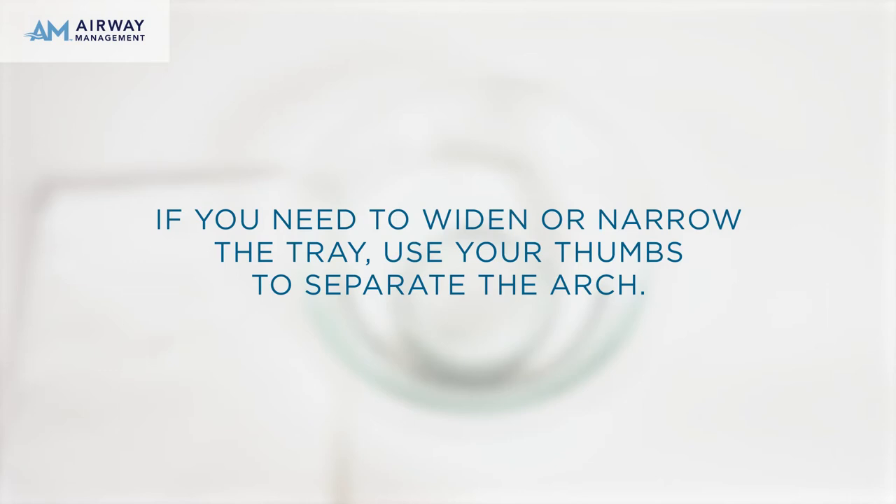If you need to widen or narrow the tray, use your thumbs to separate. Before biting down, check the alignment so that the clear post is directly beneath your nose. Place the mouthpiece into your mouth for 2 minutes. Apply pressure against your teeth by using the clear post of the mouthpiece as leverage. Suck on the mouthpiece while pushing with your tongue up against the back of your teeth to seat the mouthpiece.